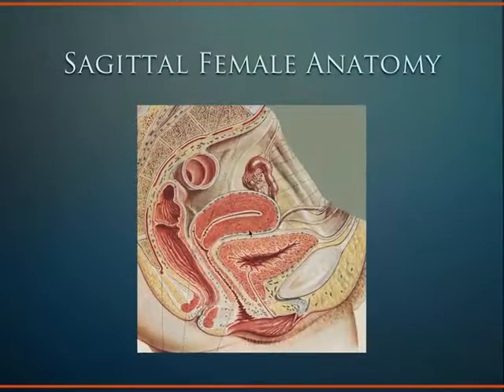So what we're seeing here is a relatively empty bladder, and we see the vaginal vault here, and this is that anteverted uterus coming back up towards this bladder. Now the less full that bladder is, the more anteversion that you're going to have. As this bladder fills, it's going to push the fundus of the uterus posteriorly or in that direction. Okay? And so just keep that in mind. This is the posterior cul-de-sac or pouch of Douglas back here. This is the anterior cul-de-sac over here, the vesico-uterine pouch. In both these locations, fluid can accumulate.